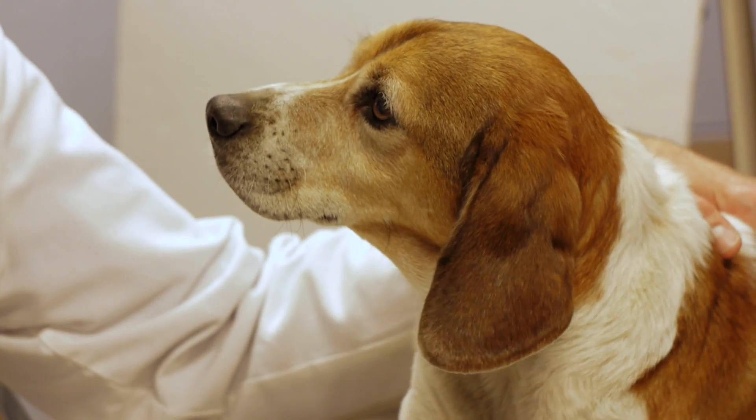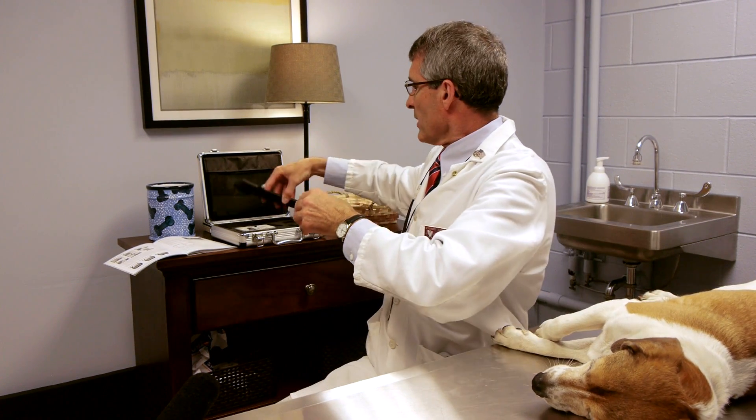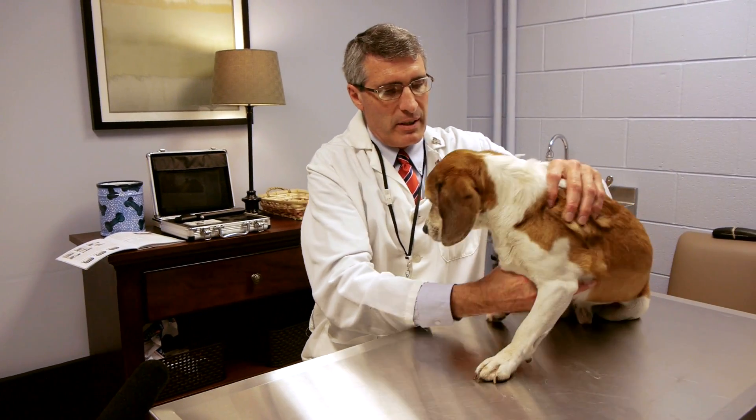You do not need topical anesthetic for this instrument. Basically, you're going to have the animal sit up for you. We're going to use Prince here, my own beagle. Come on, buddy — let's sit up. Good boy.